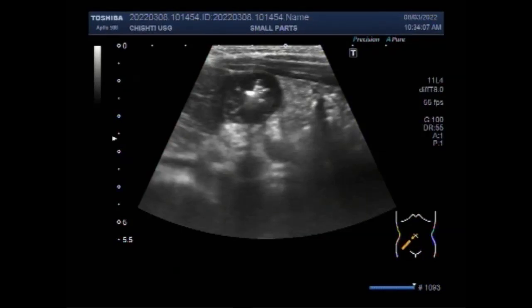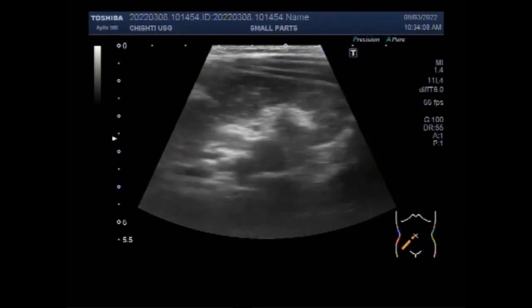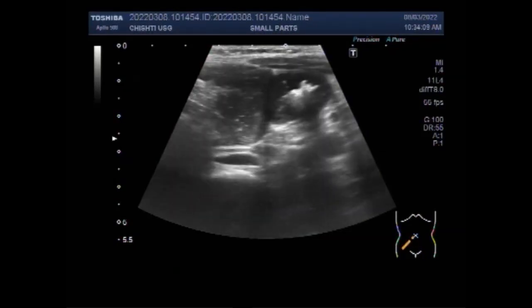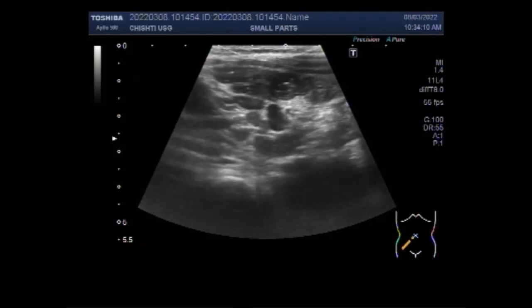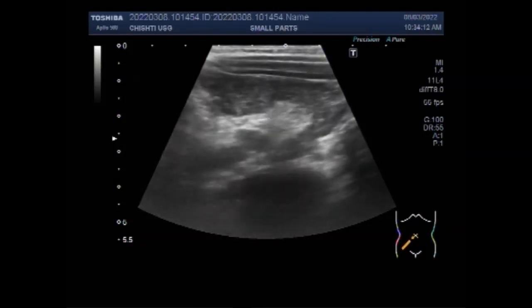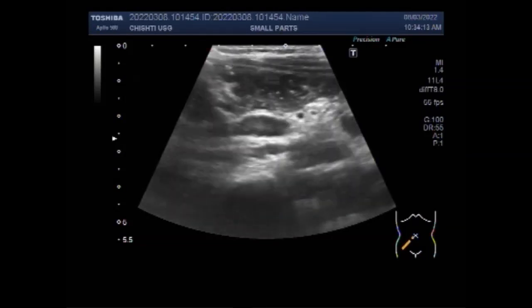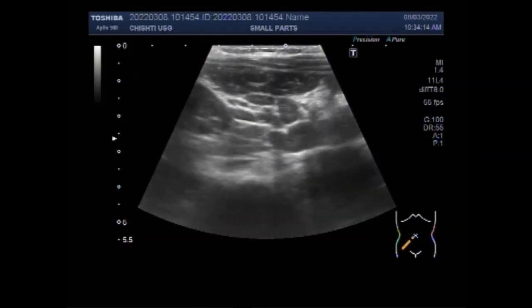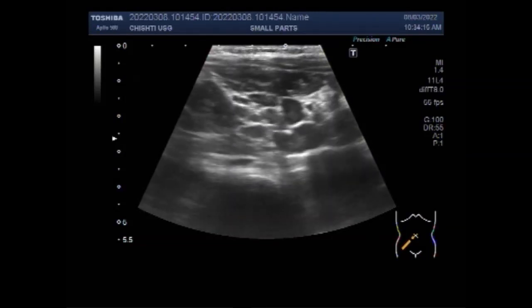Dear viewers, I hope you are all fine. This video shows a case of enlarged mesenteric lymph nodes in a child of about three and a half years.